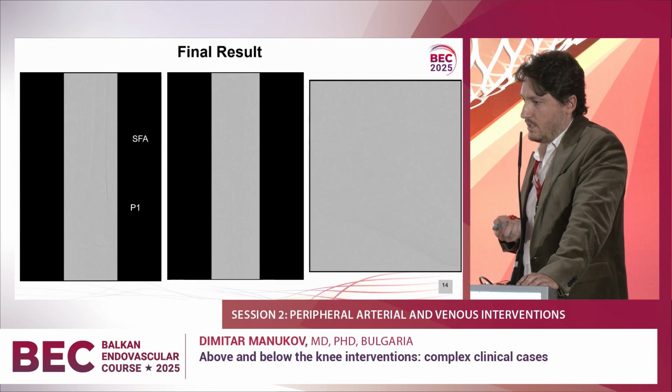And finally, this is the final result we have in all the segments that we treated, starting from the left, the femoral artery, the P1 segment, as you see.